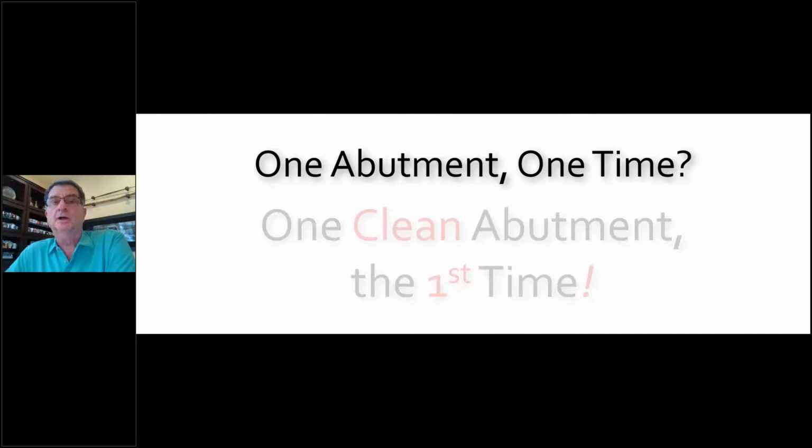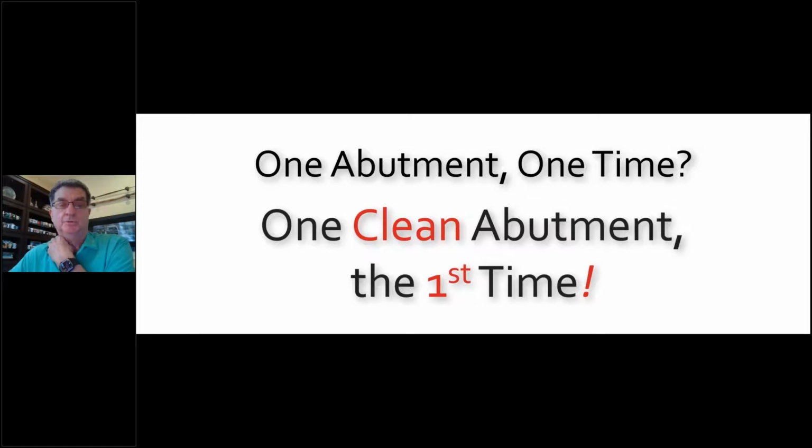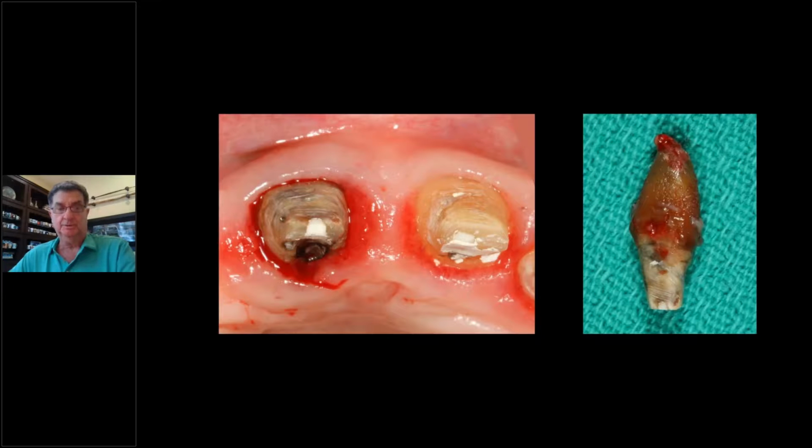So one abutment one time is what we all hear about. So keep the tissue attached to the abutment. That's true, but you can't always do that. But I came up with the term one clean abutment the first time, and that may be enough for us to make this happen, and that seems to be okay. So even if you change it multiple times, the key is the initial healing. Get that tissue to adhere to your acrylic, and then you have to disrupt it to get it off, but it works out pretty well, and that's what we're looking at.